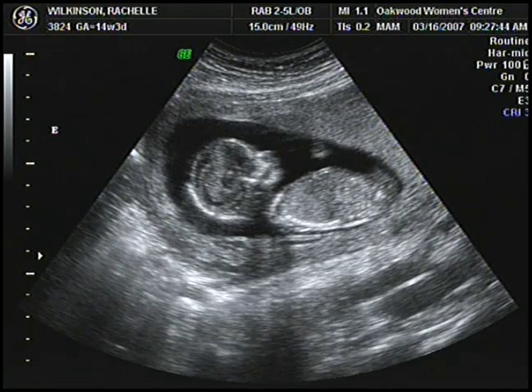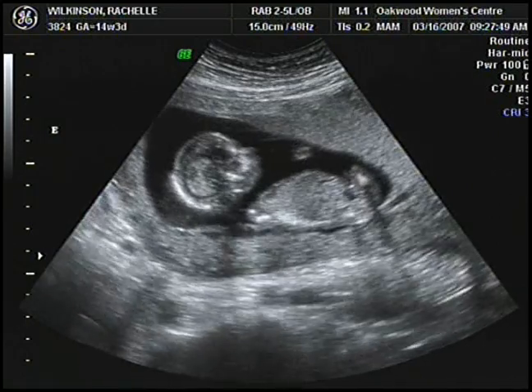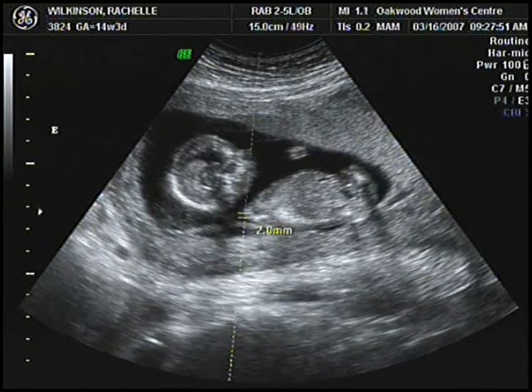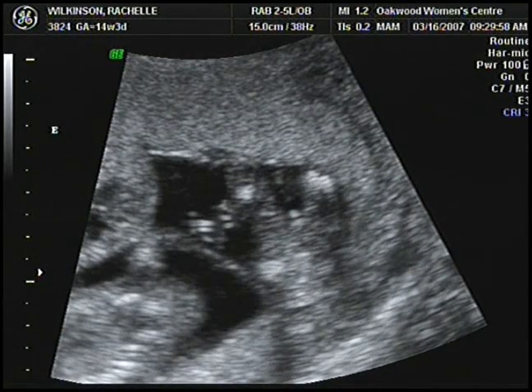they're developing well. This shot I picked because there is a really nice little profile that you can see of this baby's face. This particular one I chose because this shows the sex of one of the babies, and I'll just leave that up to you to determine what sex that ended up being.